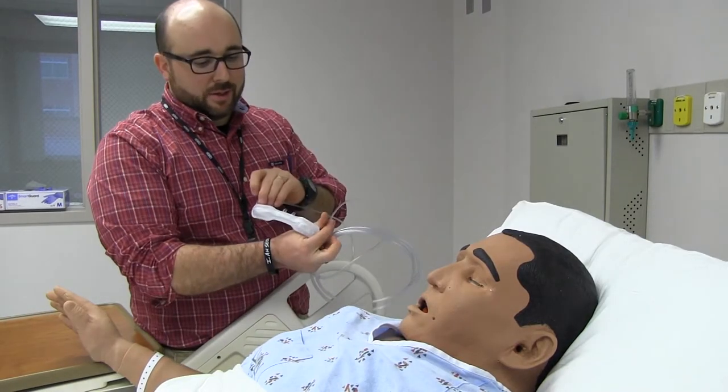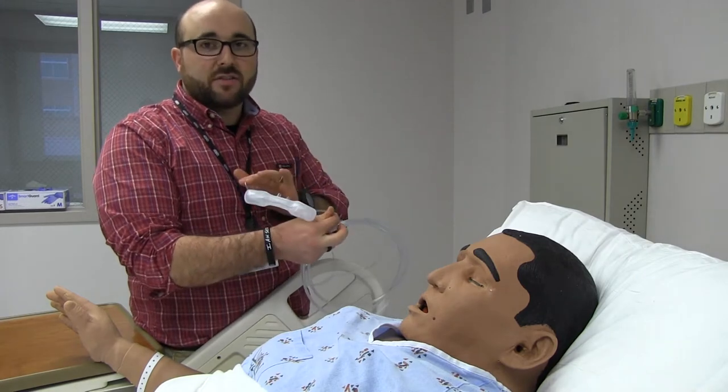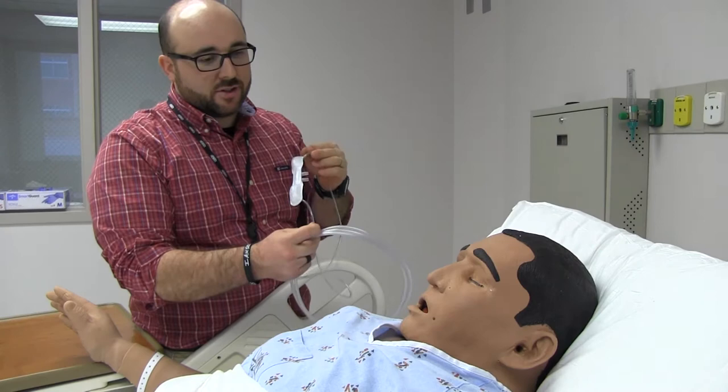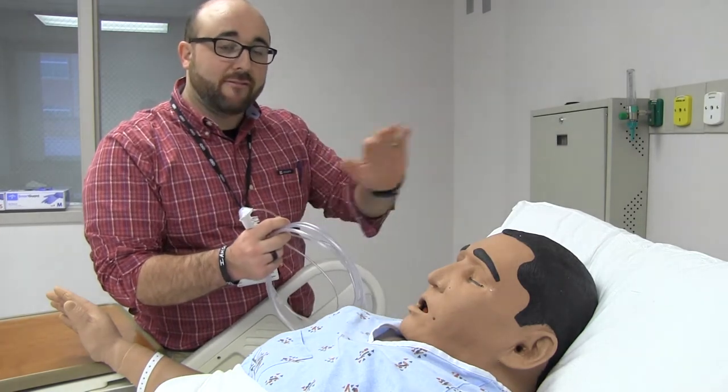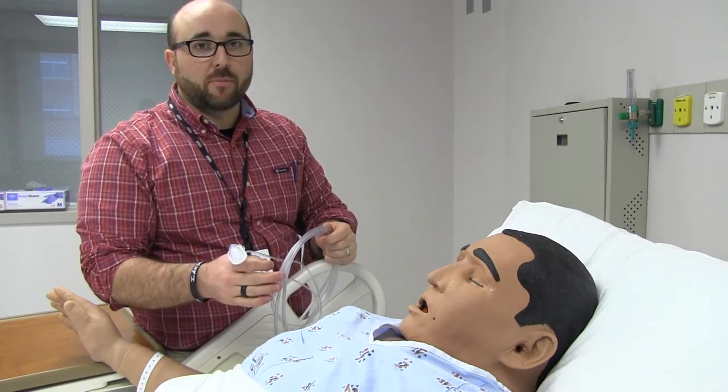If you see one of these devices, it looks a little bit weird. Some people call it the mustache. This is an oxygen conserving device. The brand name is Oxymizer. What this allows us to do is give a larger FiO2 to the patient while getting a lower oxygen flow from the flow meter.